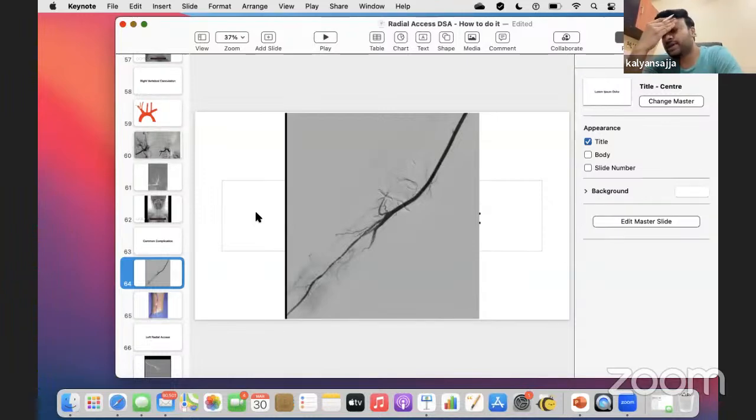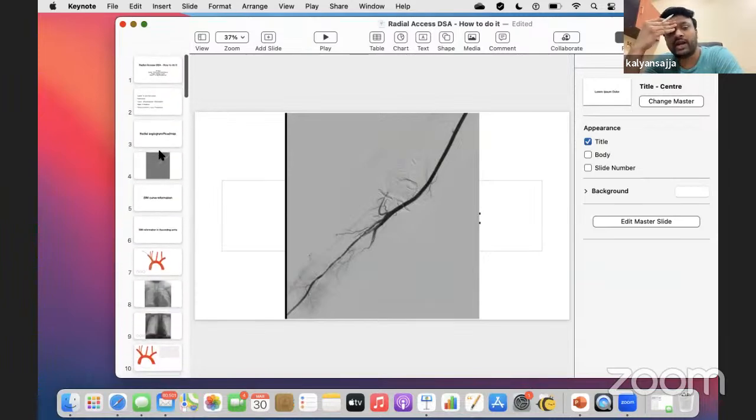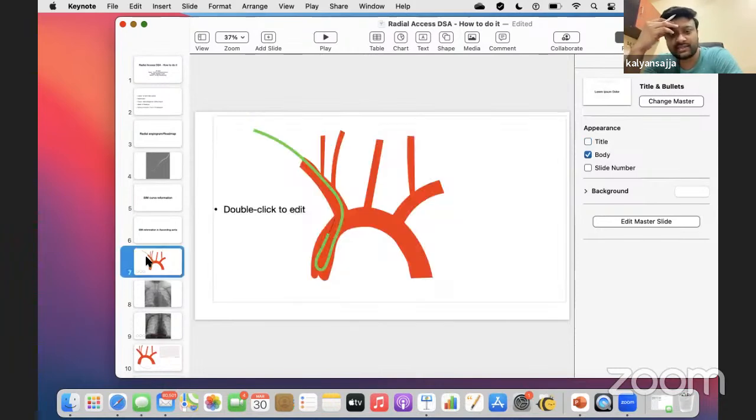When you're starting out, I'd recommend shaping the SIM in the descending aorta. I know many times it just goes directly into the ascending. For some reason, I'm not sure why. In the Indian cases that I did in the last 3 years, it was always going to the ascending and I was shaping it. But in the US, it almost always used to go into the descending aorta, or maybe into the descending arch. Maybe I was trying to make it go into the descending, but we should always make an attempt to let it go into the descending arch.